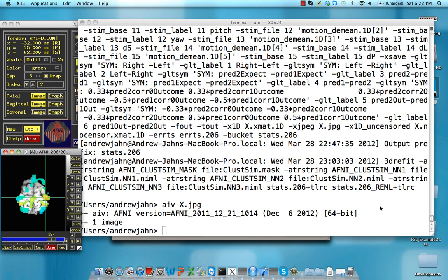Be aware that if you're using this to calculate a p-threshold based on a t-statistic and an associated degrees of freedom, the degrees of freedom can be misleading because not all of your time points are independent. There's a certain amount of correlation in your time series, or temporal autocorrelation. This can inflate the number of data points and therefore your degrees of freedom. So just be aware of that when you're using this tool.